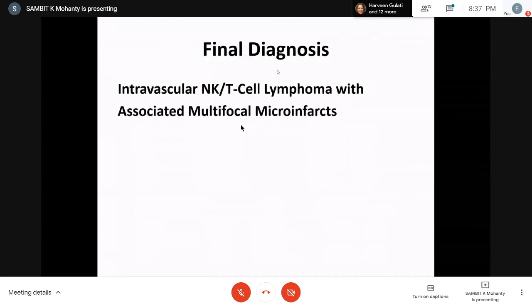Plasma cell neoplasm can be CD3 positive. Yes, it has been reported. There are reports of CD3 positivity, but our question is, because it is a lineage specific marker, aberrancy is rare in those markers. Another comment, in this particular case, was, what about the c-MYC status? That I have to check. I do not even know if they have done the c-MYC in that particular case.